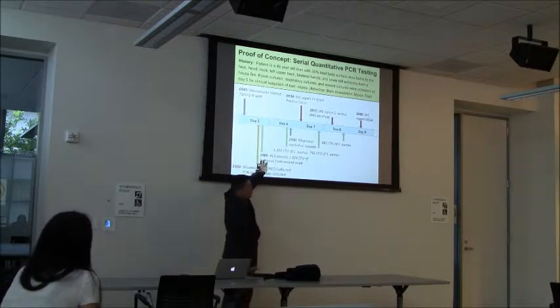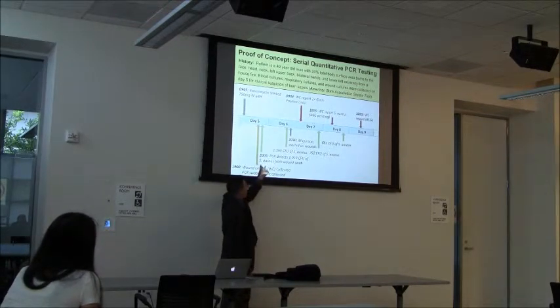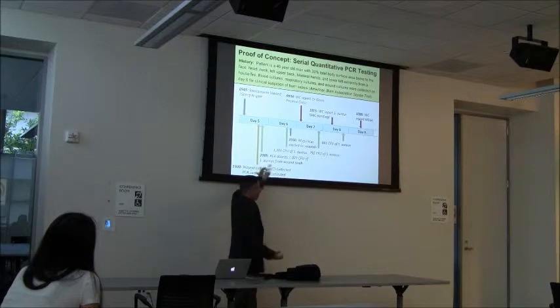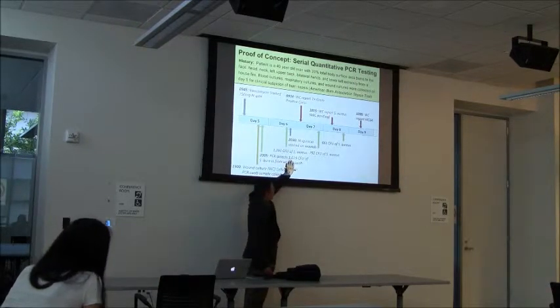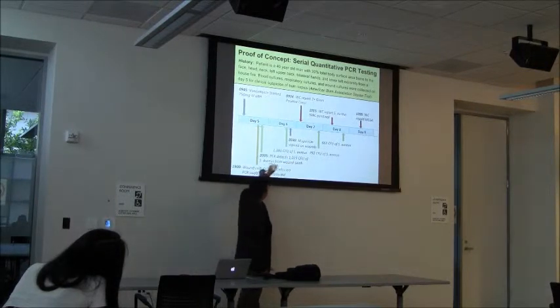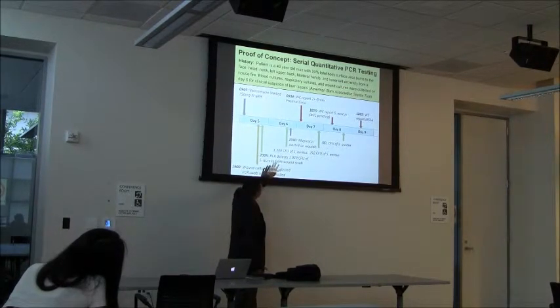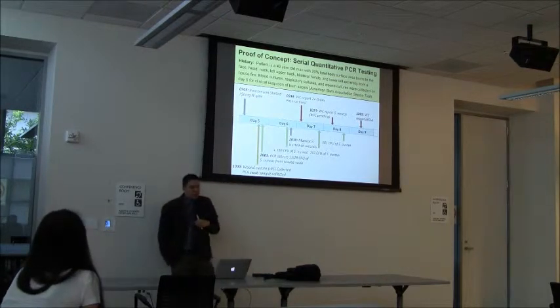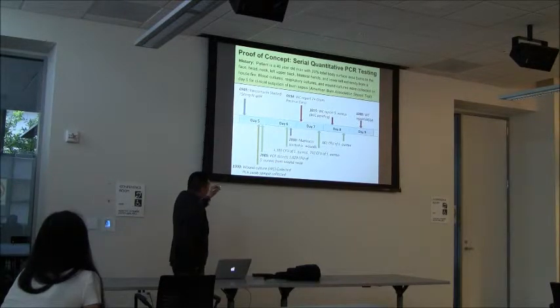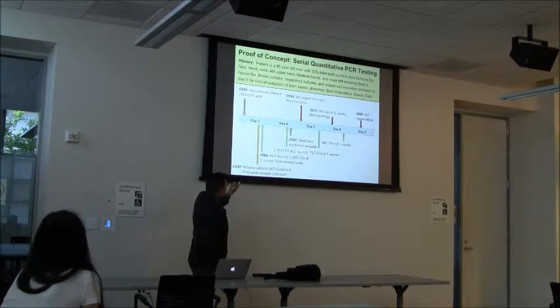At 2005 hours, we were already able to identify that it was regular Staph aureus, not MRSA. By the way, they had already started him on vancomycin, right here. And we were able to quantify how much bacteria was there, 1,029, based on the nucleic acid count. On day 6, the doctor finally said, okay, let's treat that wound infection. They put a topical on it called mupirocin. I actually collected a sample before that, and we see the numbers of bacteria increasing because they hadn't started treatment yet. They started treatment here at 20-30 hours.